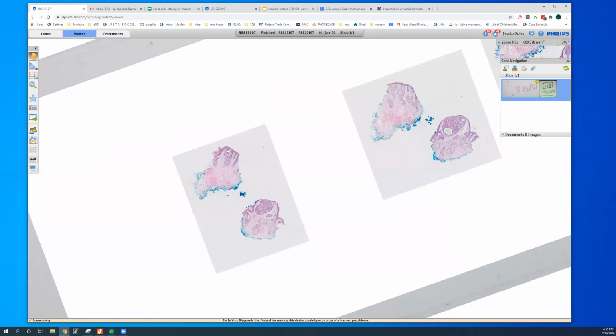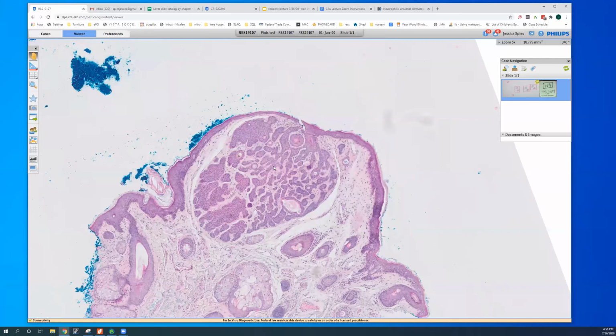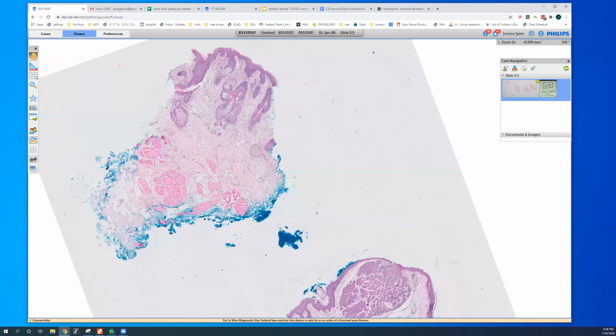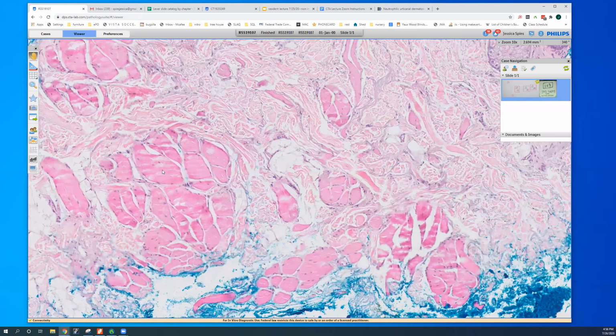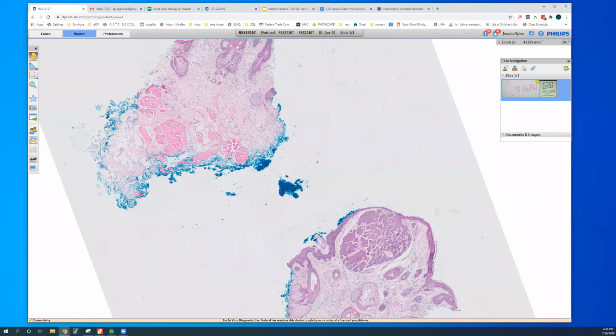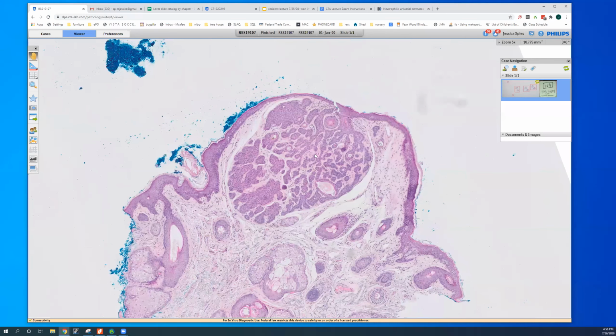Okay, here we go. That's actually not the lesion. Here we go. First of all, where are we on the body that we have this skeletal muscle here so close to the dermis? Where could we be? Neck. It could be eyelid for sure. Yes, I like eyelid. Yep, eyelid. Yeah. Okay.